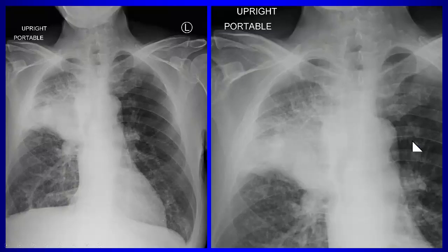So you need to be suspicious from the chest radiograph, right? Anybody with pneumonia, look very carefully at the mediastinal contours. If there is anything that looks like mass or lymphadenopathy, that patient needs a CT scan with contrast, a routine chest CT, not a PE CT. Okay.